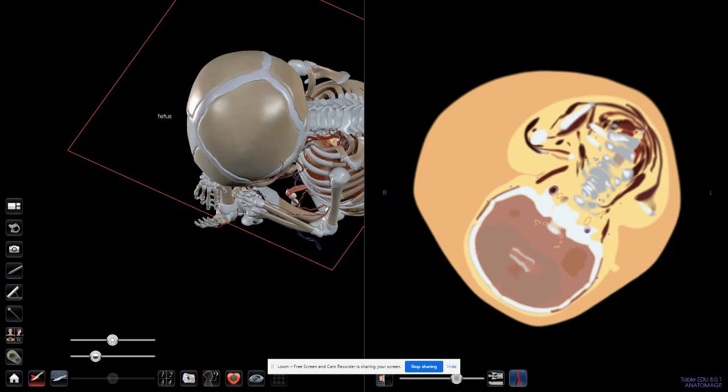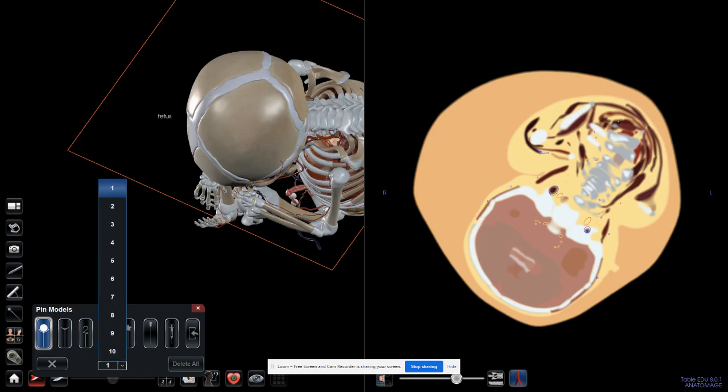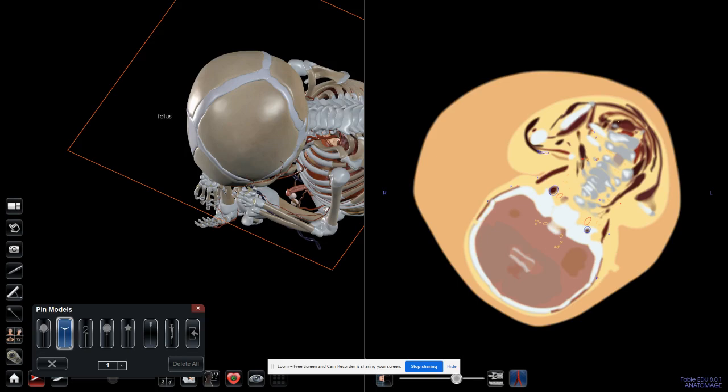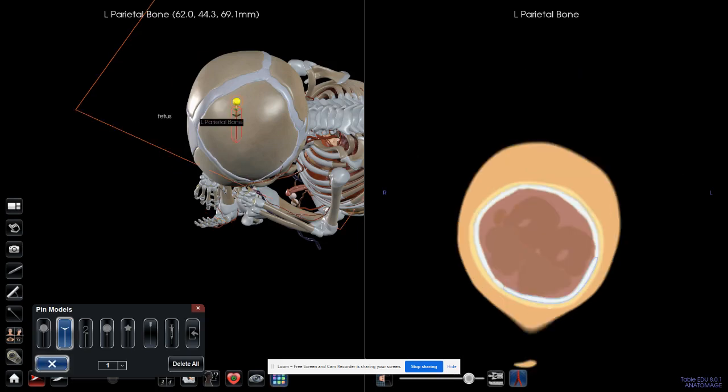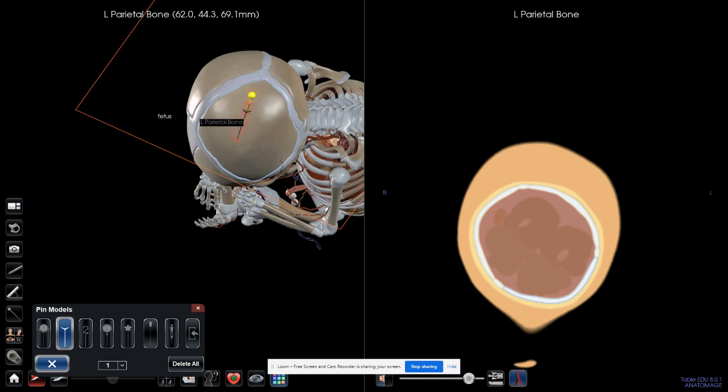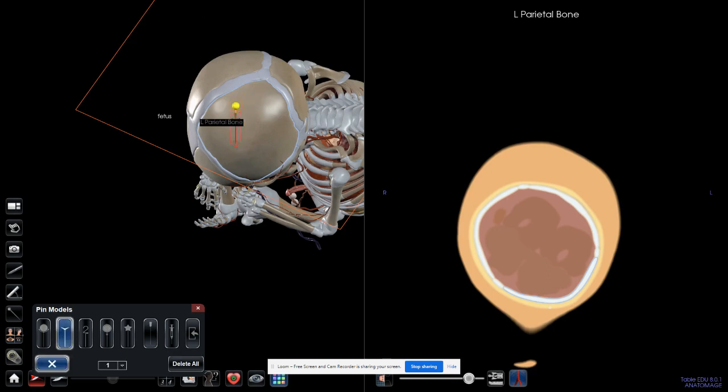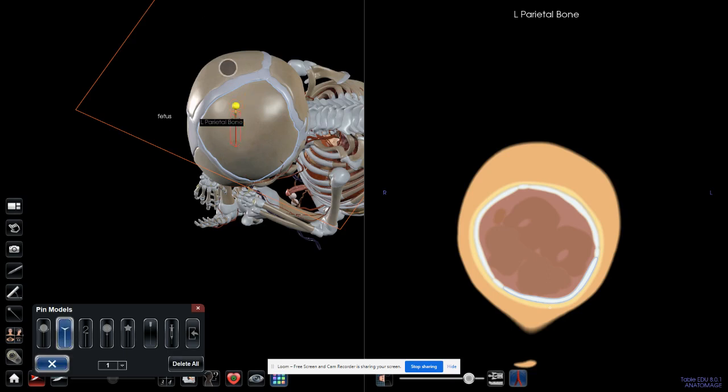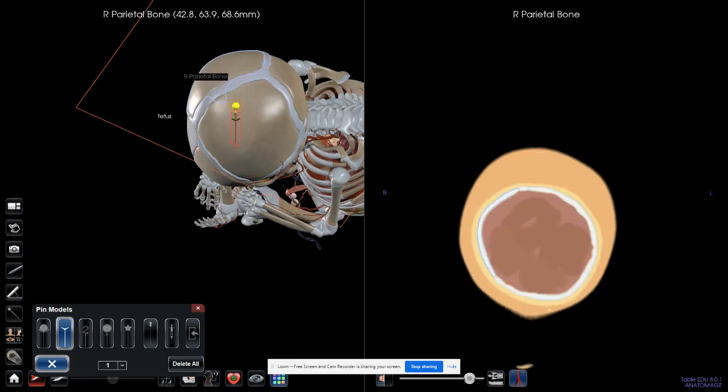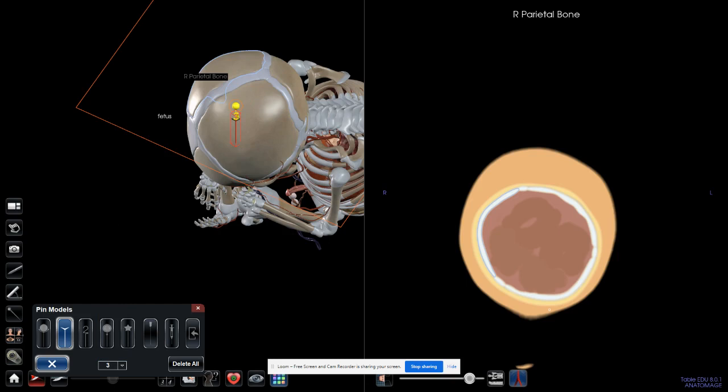The pin, which is one of these modules, allows you to select 10 pins for each one. Say I want to select this one and put it on the parietal bone. I can spin, I can adjust its size and rotation. Unlike what I have done with the pen, if I want to remove it, I simply click delete. If I had added multiple, this is number one, I want to highlight this as number two or this one 10, whatever. As you can see, this is named three, this is 10.